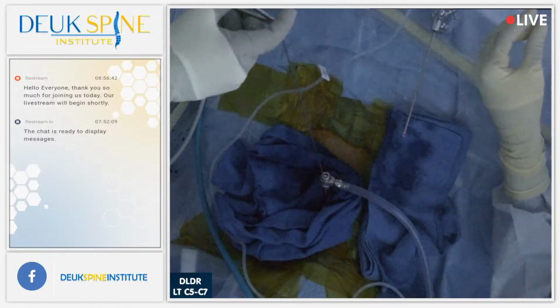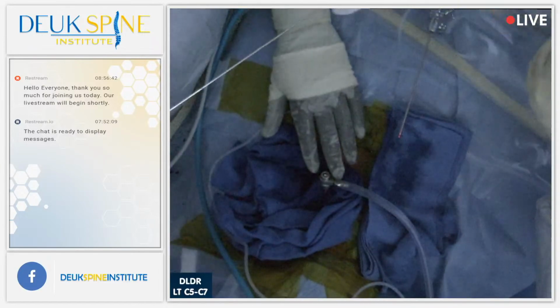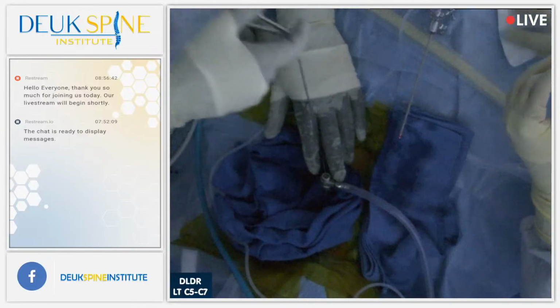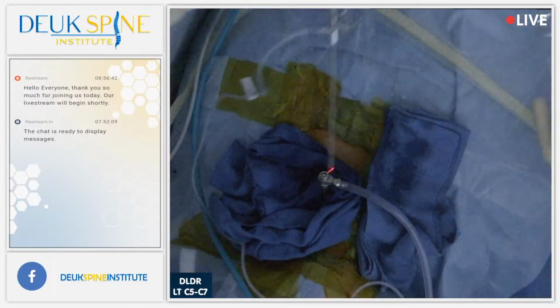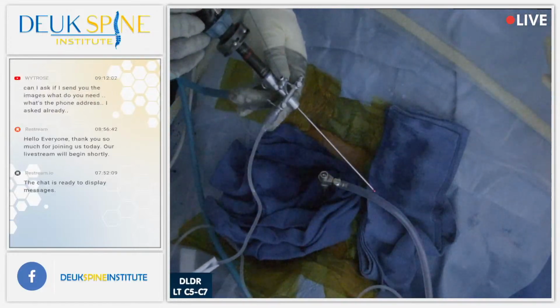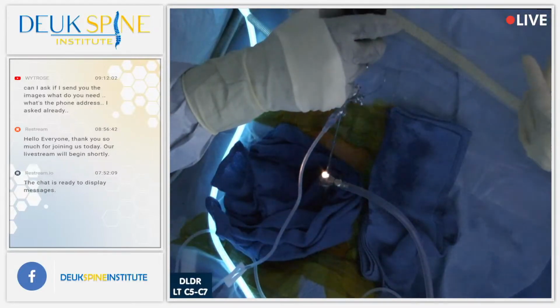If you have questions, feel free to ask us. We type them up and we'll try to answer them for you. There's a piece of herniation there. It takes about 15 to 20 minutes per disc once we're in. And after we're done with this disc, we're going to move to the next disc, which is the C5-C7.